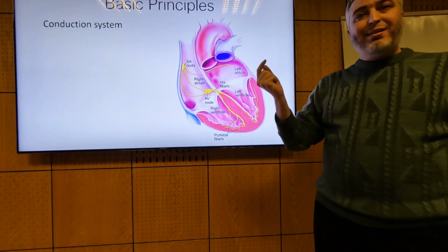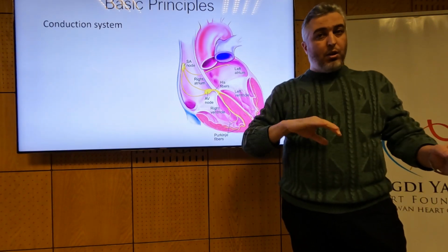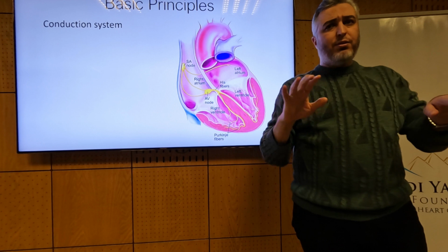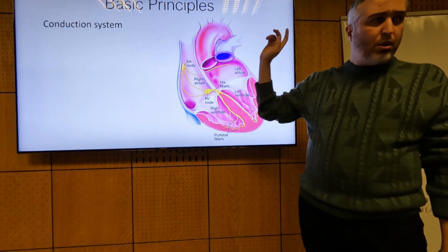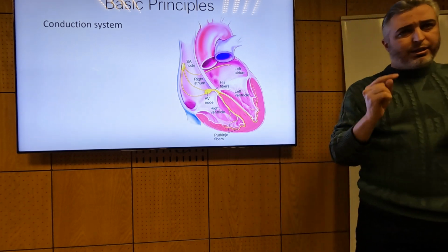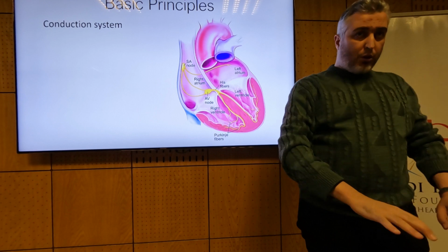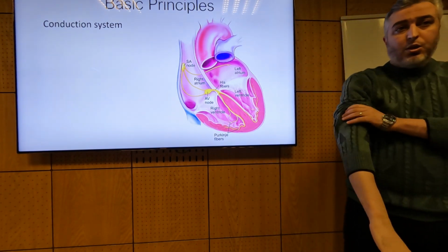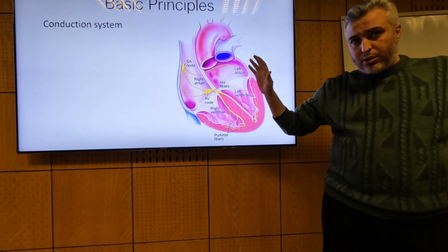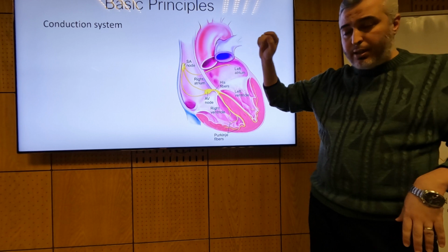So when the atrium wants to contract, it will find the ventricle contracted with a lot higher pressure and a closed valve, and then this atrial contraction will not be useful. To get benefit from the atrial contraction, which is quite important to increase the filling of the ventricle, which increases the cardiac output, you want the atrium to finish contraction before the ventricle starts. And that's why the AV delay.